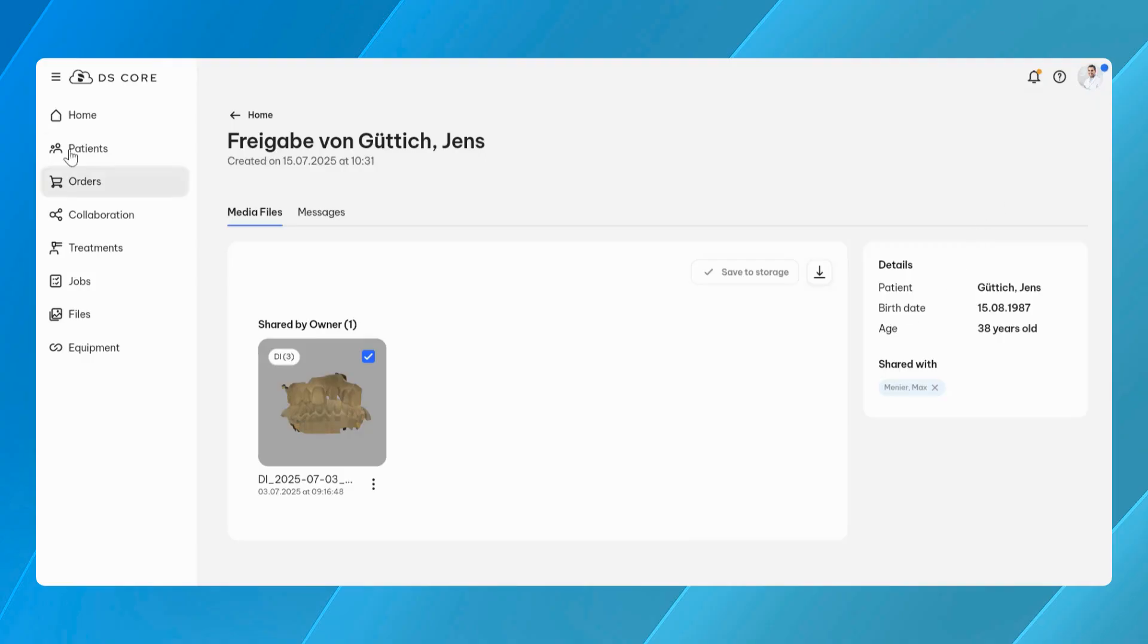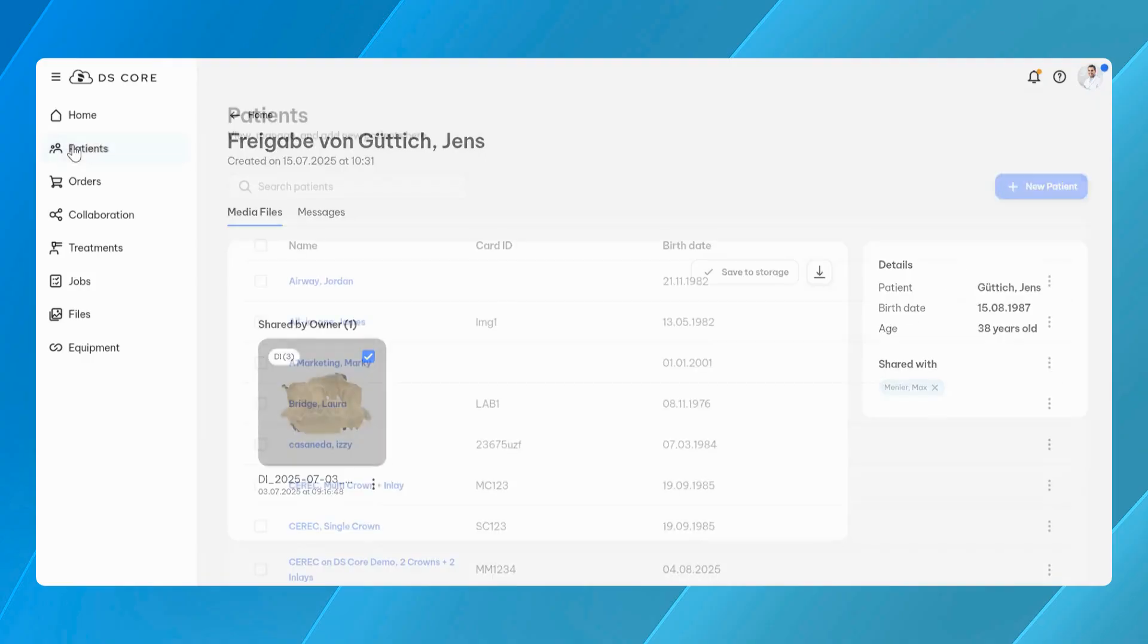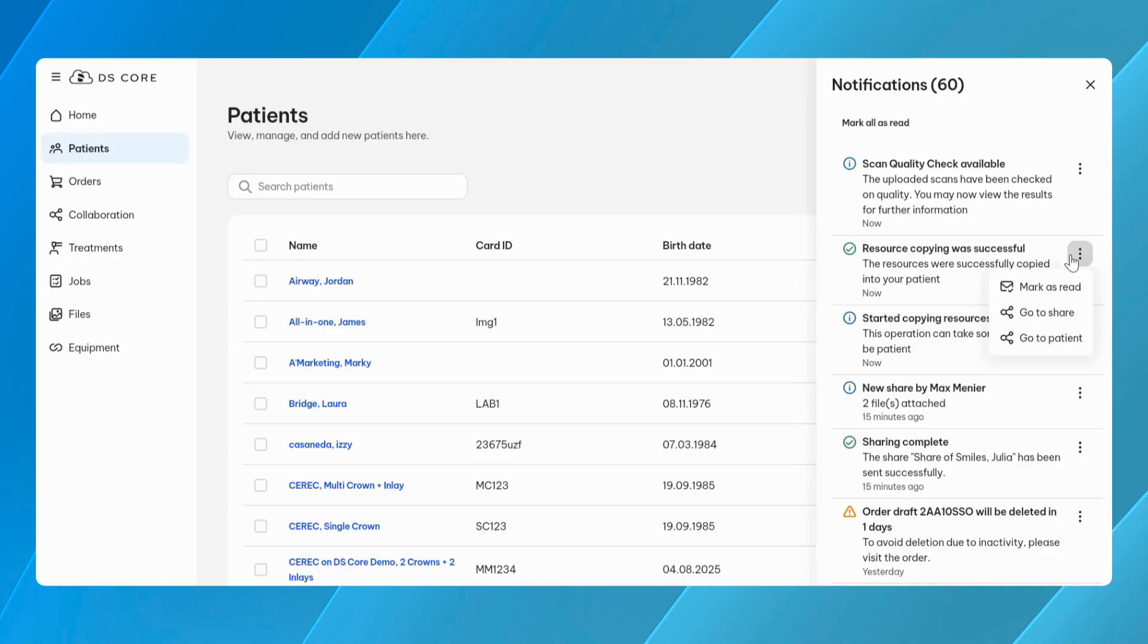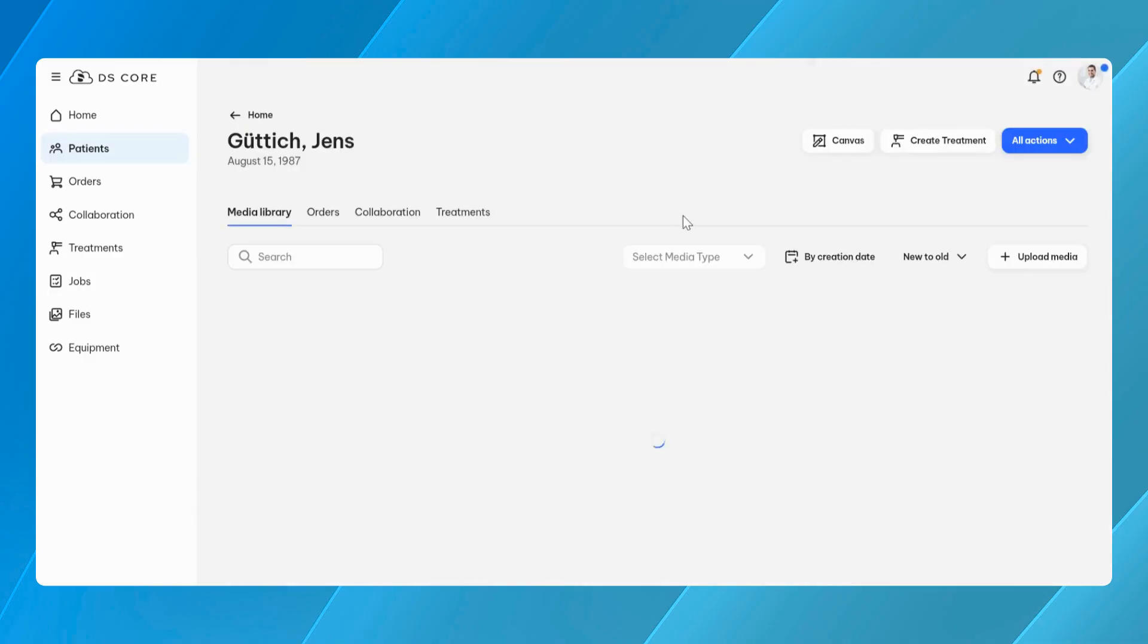For the initiator of the share, this feature also provides value. When files are returned by a specialist, they can be saved directly into the original patient's media library, ensuring that all relevant data is consolidated in one place.